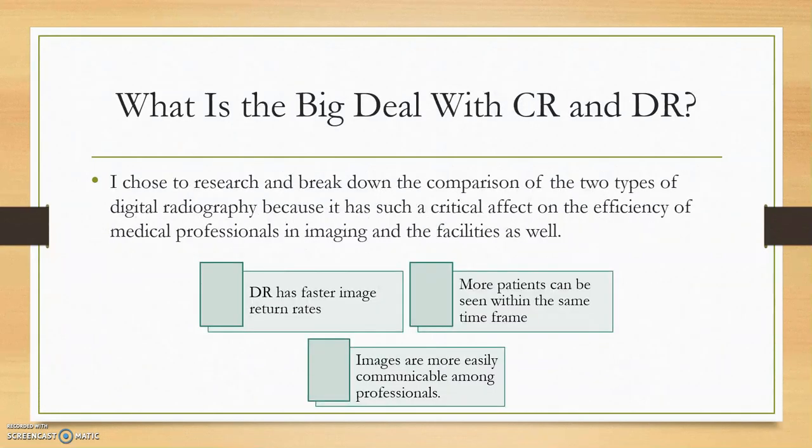So what's the big deal with CR and DR? Basically, I was determined to select the topic because they're both popular modalities that can be really considered the heart of a radiologic technologist's career, which many students, like myself in this program, are studying to become. As I mentioned, when a facility chooses to use one system over the other, it affects mostly all professionals involved in a patient's recovery, even all the way to the receptionist who schedules the patient's appointments. With the use of DR at a busy location, more patients can be scheduled in an hour's time than with CR. It's just more cost effective that way.